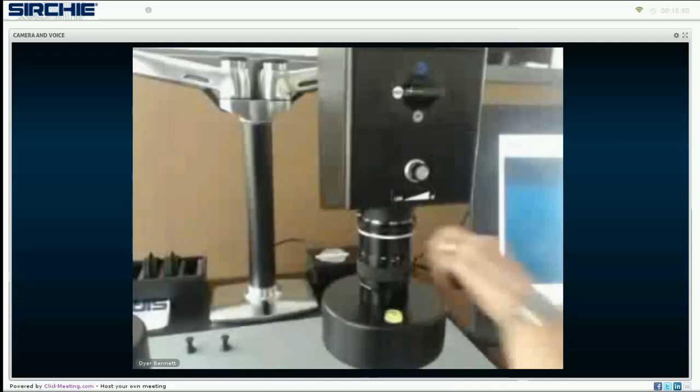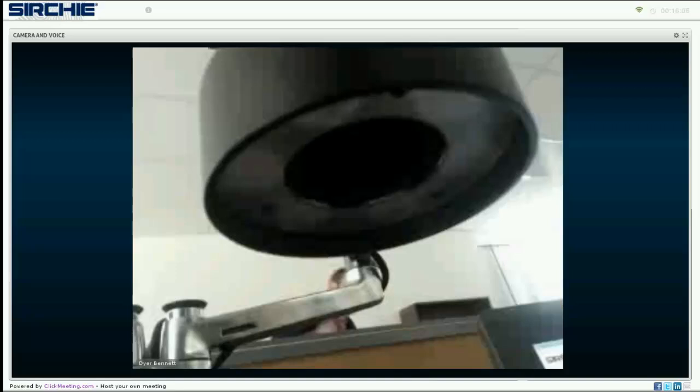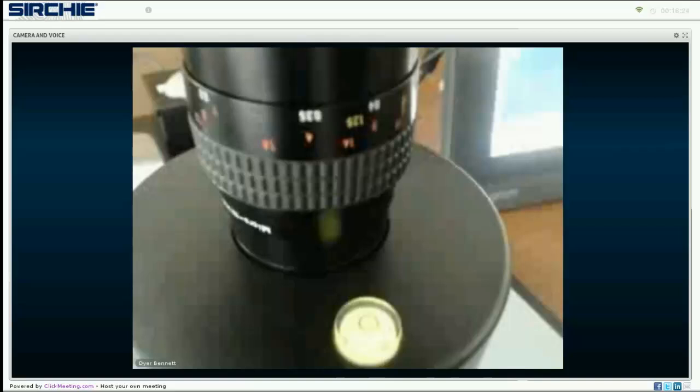We also have the filters, which are magnetic, easily attachable and easily removable — no screwing required. You don't have to screw into any fine threads or worry about ruining them; they just easily attach by magnet. One final feature: we have the bubble level. When we want to capture a photograph, we use this level to make sure the camera is at a 90-degree angle to the table.